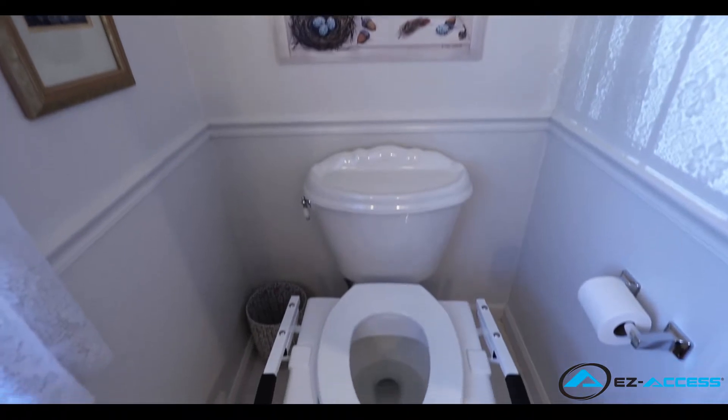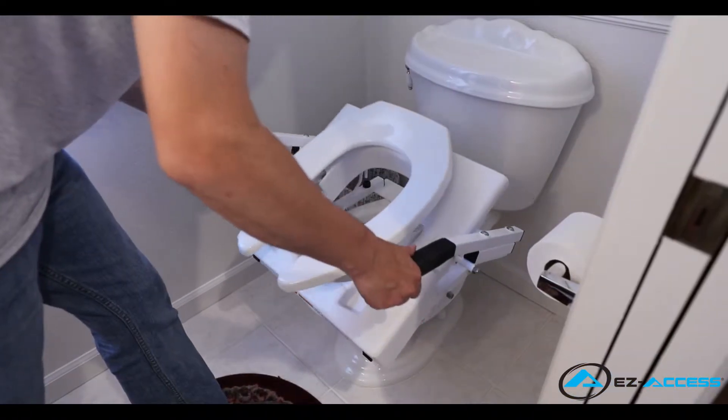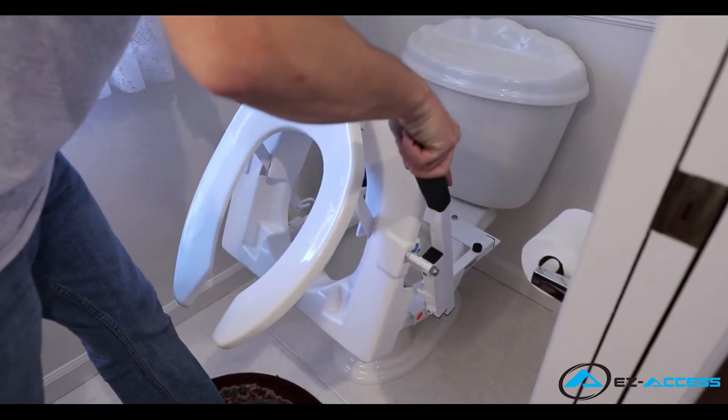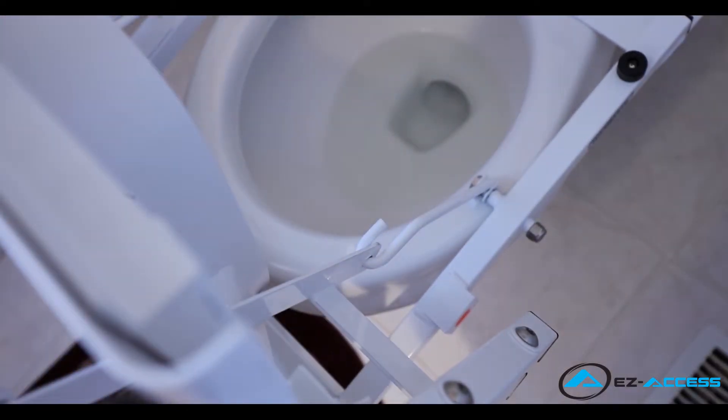You can now prepare to position and mount the actuator. Grab the two handles and pull them forward until the tilt is fully raised and slightly overextended, allowing the tilt to stay in position while the actuator and actuator mount are being installed.